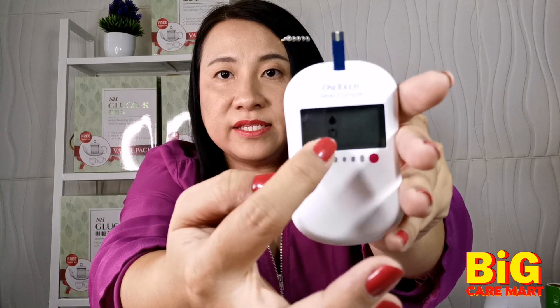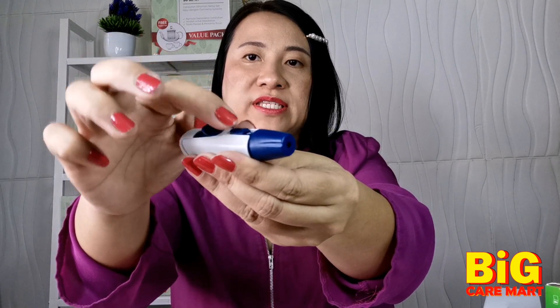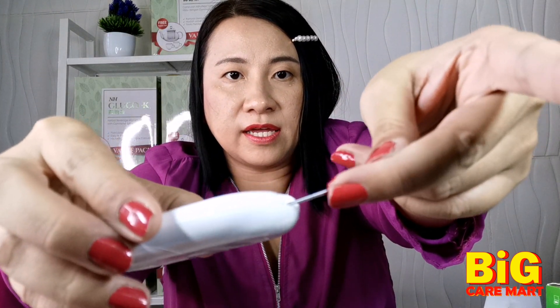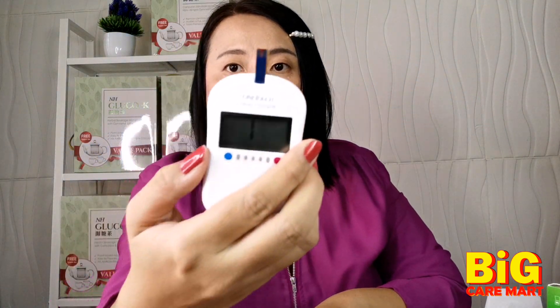When you see the symbol on the screen, you can start. First, use the alcohol swab — just two wipes — and make sure it's dry before you poke. Pull the trigger like elastic and press here to do the blood test. Once it's dry, just poke it. You can see the blood coming out, then put the strip on the side here and it takes the blood automatically.